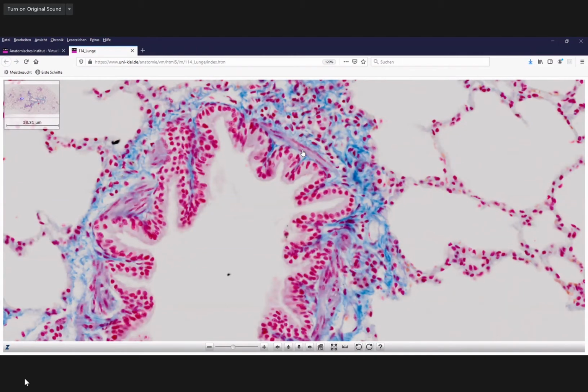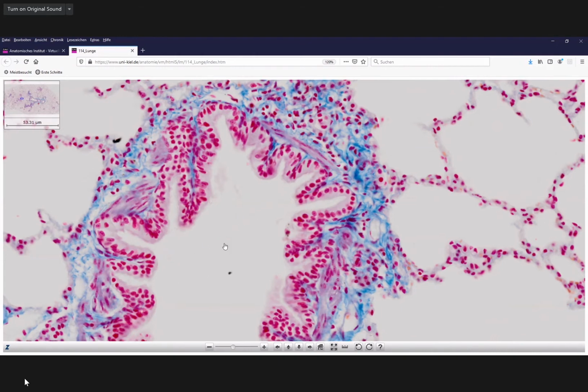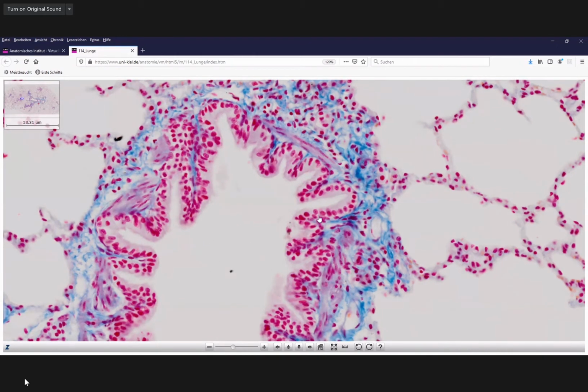Endothelial cells. No. Then you need a lumen. Right. So this is the big lumen of the bronchiole. Here is the epithelium. As we just discussed, it becomes now more cuboidal, simple. Goblet cells and ciliated cells will decrease in number more and more, and club cells appear instead.